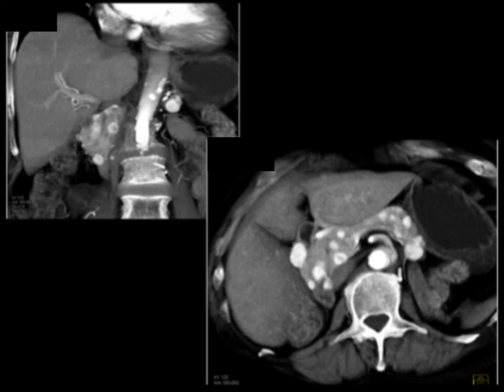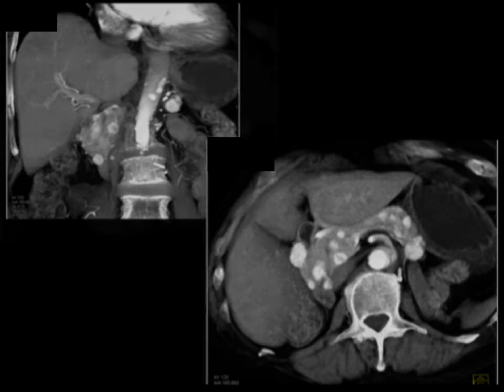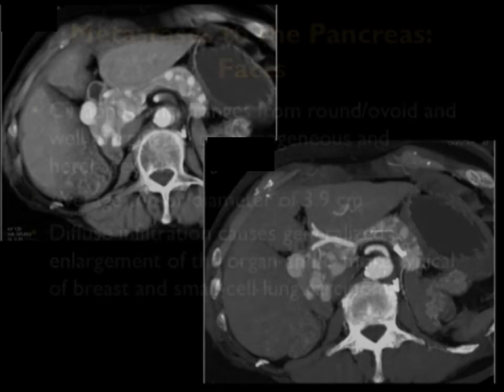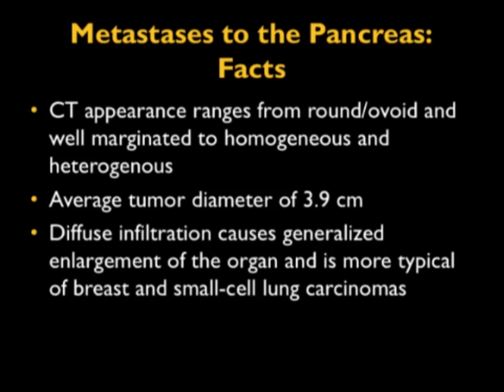Usually when lesions are less extensive, surgery is the ideal thing because we've seen many patients get surgery, have no other Mets, and then do fine for many more years. In this case, they decided to treat the patient with chemo, but look at the extent of involvement. Indeed, very impressive.